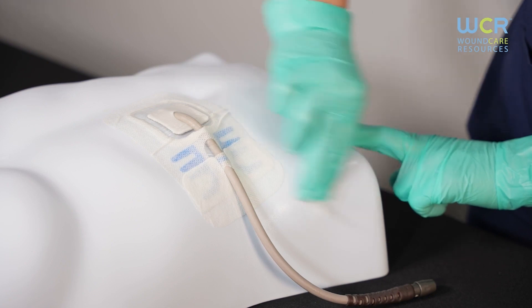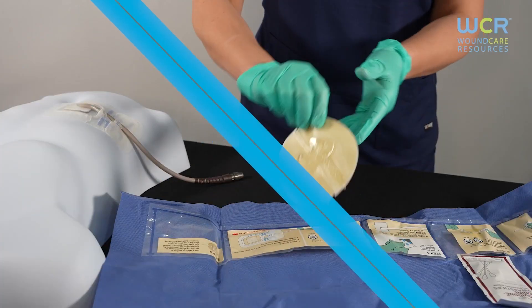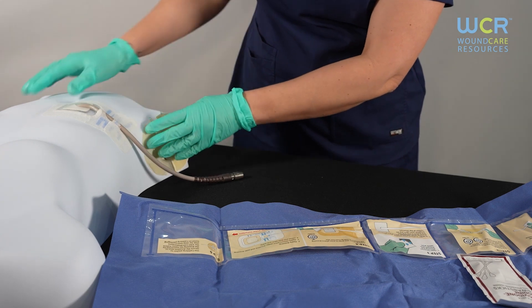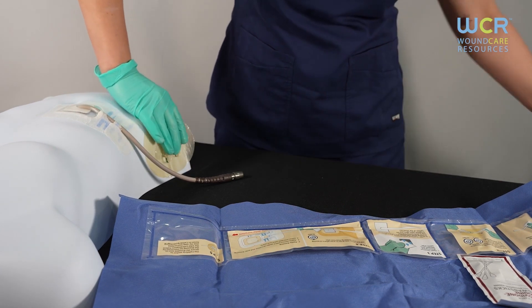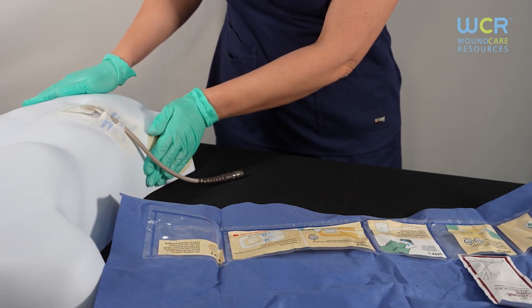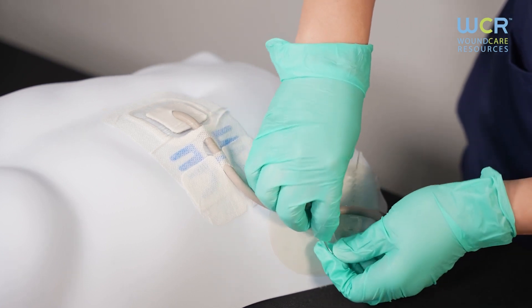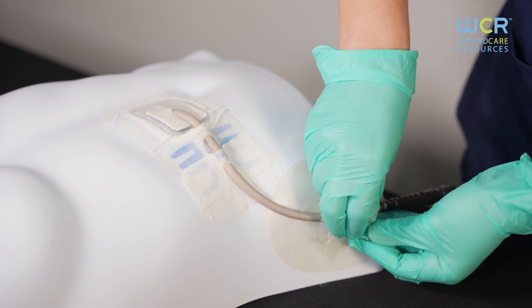Finally, Step C is the Cath Grip Securement Anchor. Remove one half of the backing, place on the skin and press. Then remove the remainder of the backing and press and hold for 15 seconds. The hydrocolloid adhesive is heat activated, so allow the heat from your hand to warm it and ensure it sticks properly. Once secure, place the driveline tubing over the straps and pull the longer strap over the driveline, inserting it through the slit on the shorter strap and pull it tight against the driveline. You want this to be tight, but not restricting the tube.